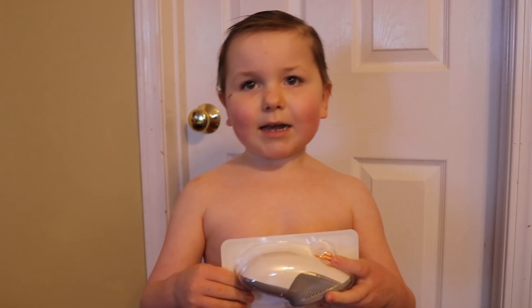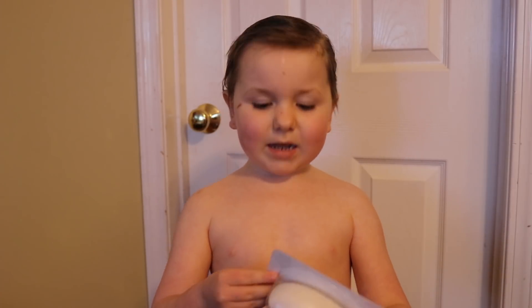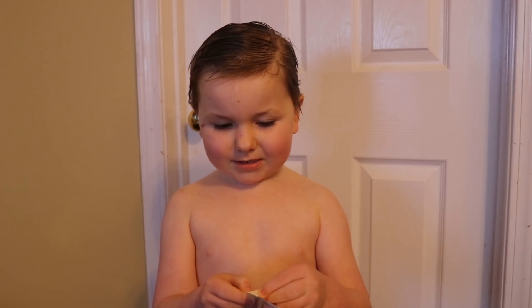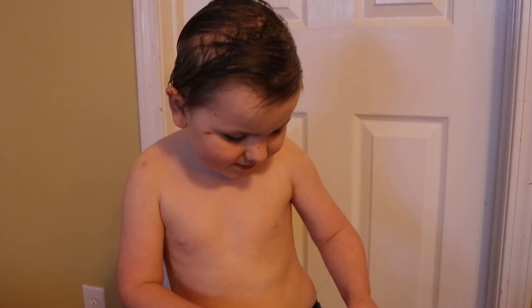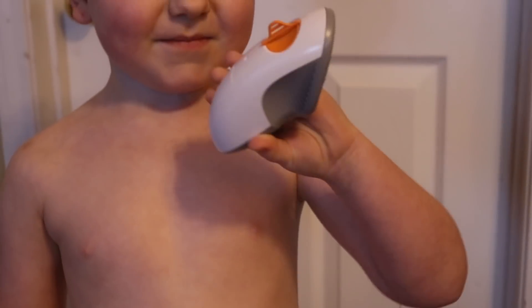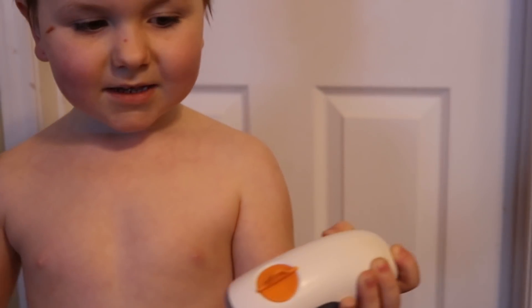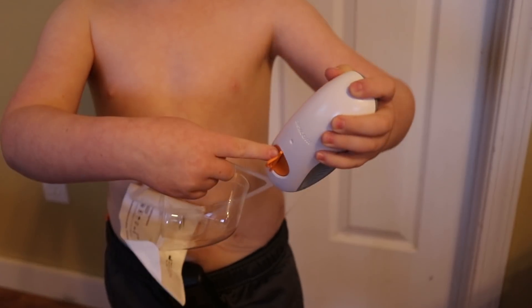This is what the Dexcom G6 insert looks like. Let's open it and take a closer look. Here it is. What's that orange thing? So that orange thing — when you put it on your body, you take off that thing and then press the button.